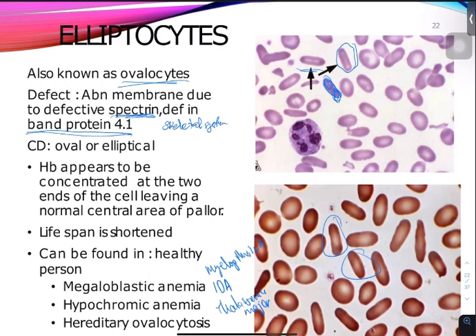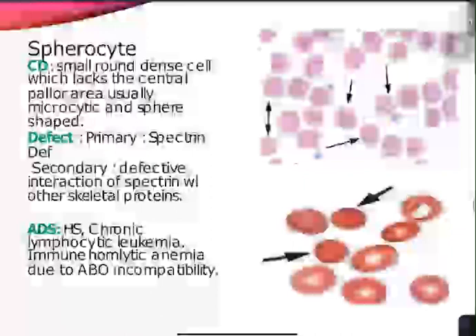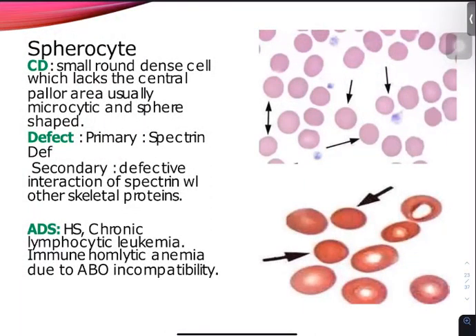Okay, additional to that. Next is your spherocytes. Okay, sinabi ko na kanina, binanggit natin yung spherocytes. Ano? They are usually ball lang, bilog na bilog, sobrang dark staining. Wala na yung central pallor mo. Bakit? Sobra yung hemoglobin content. Okay? Usually also has a defect in your spectrin.